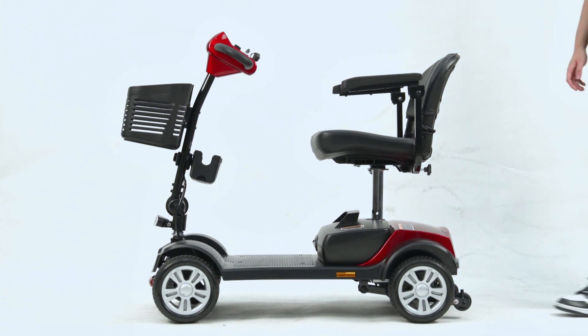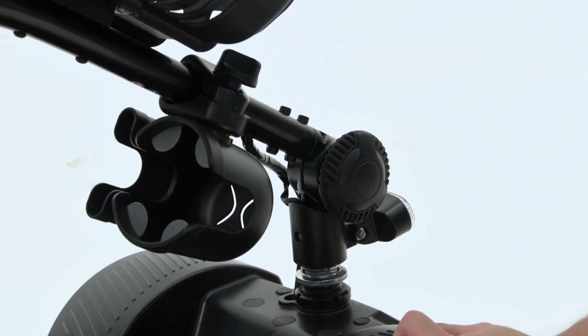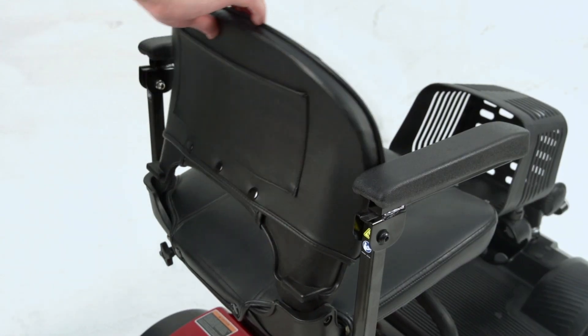Folding: First, separate the chair from the device by pulling it vertically upwards. Then, loosen the knob on the right side of the stem by twisting it. Slowly bring down the stem and rest it on the body of the device. Lastly, attach the chair back onto the device and fold down the backrest of the seat.